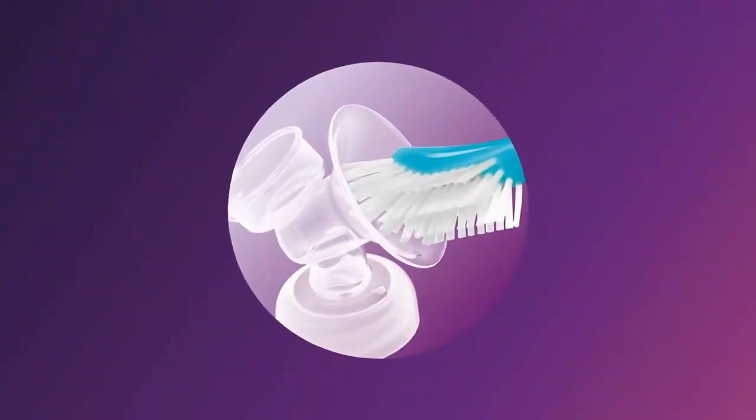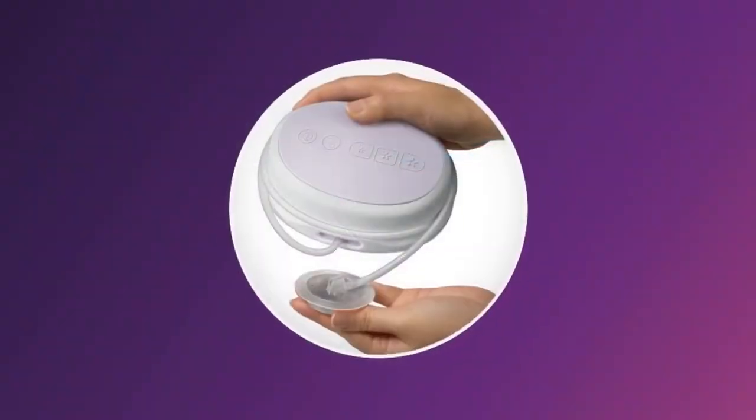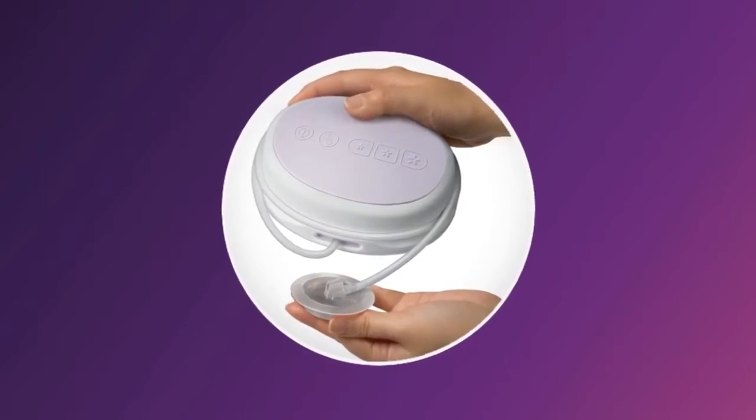The motor, silicone tube, cap, and adapter do not require cleaning and sterilising as they don't come into contact with breast milk. Clean and sterilise all other parts before each use.